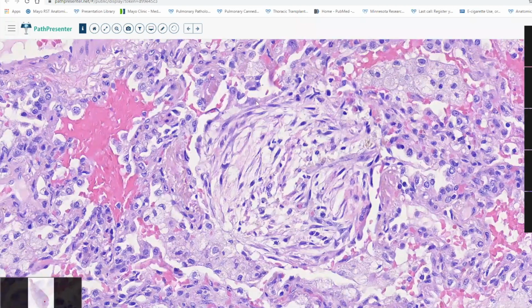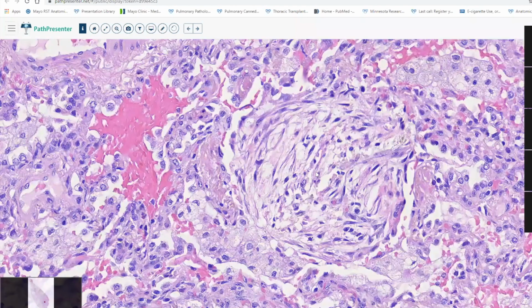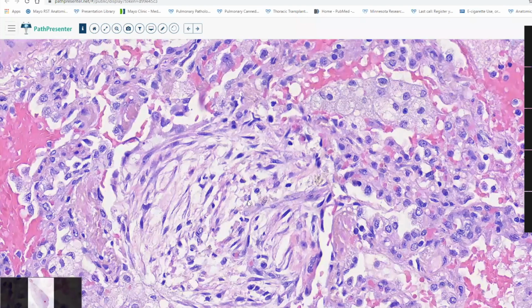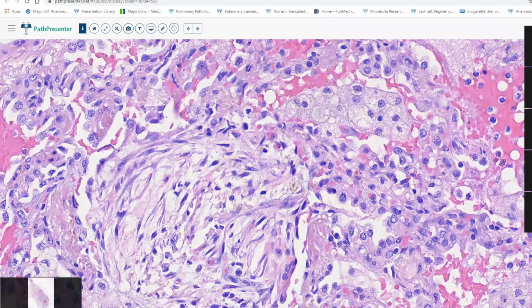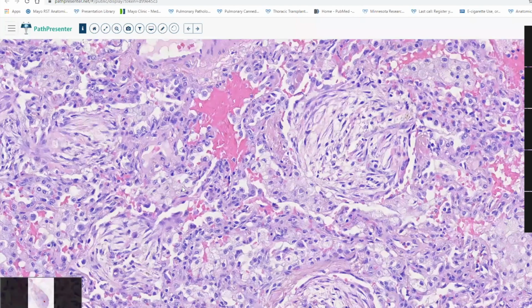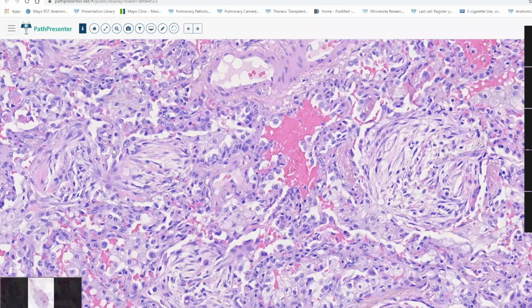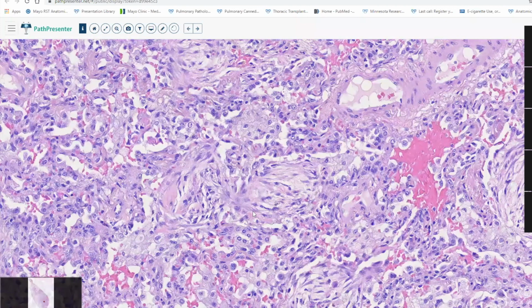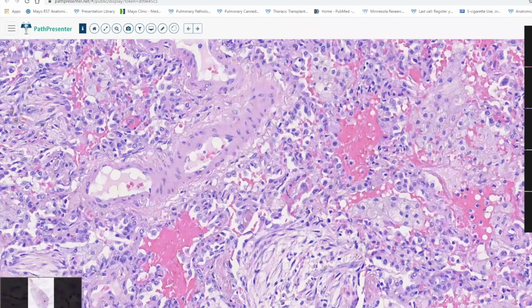In this case, we have these proliferating fibroblast-appearing structures within these alveolar spaces, and they're often described as so-called mucopolysaccharide rich, because they have this appearance of being rich in mucopolysaccharides with these clearings. We also have some foamy macrophages that are often seen associated with it. And in the interstitium, there's a bit of inflammation within the septa as well. These proliferating fibroblasts often have a dumbbell type of appearance, where it bulges out here, narrows down and bulges out again as it tracks through these alveolar spaces.